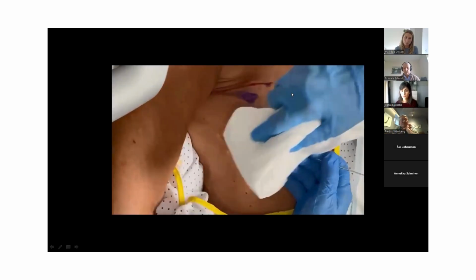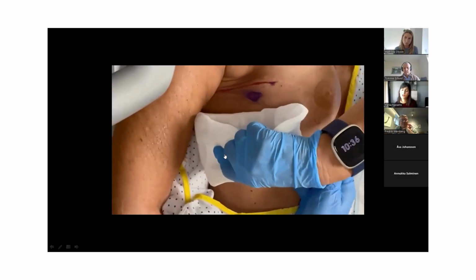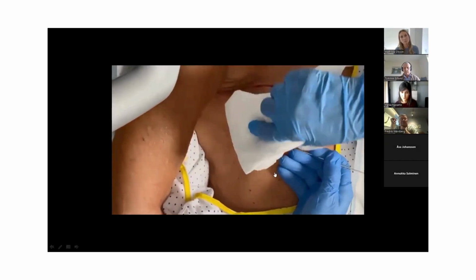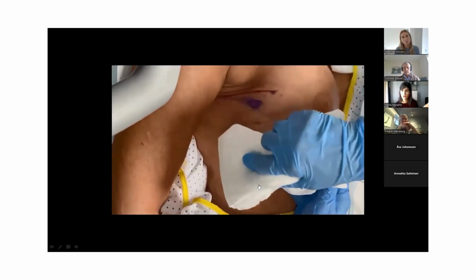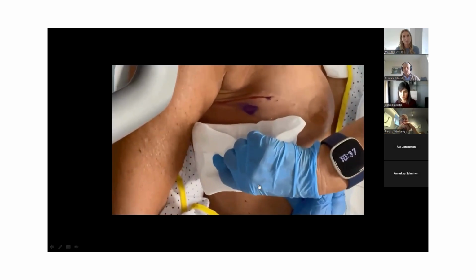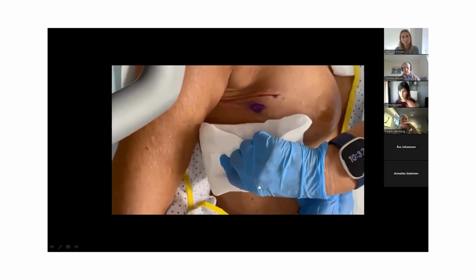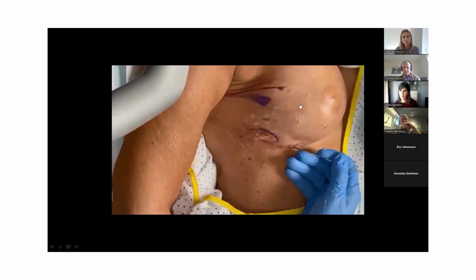And then we put our hot saline back. And you're going to see how fast and how easily the skin recovers its normal color again. You see, almost normal color again. So the key is to find this balance between freezing and helping the skin to recover. And believe me, at some point with some experience, you learn how to do this very easily.